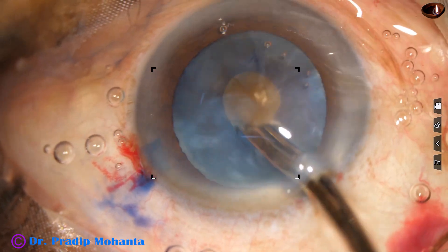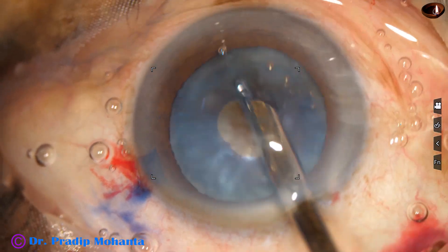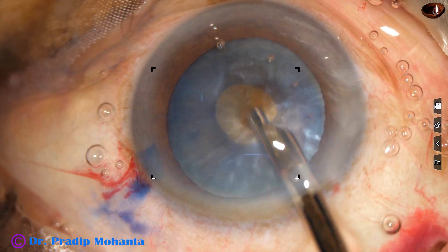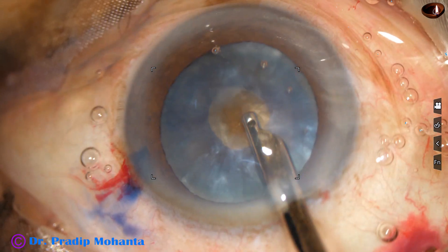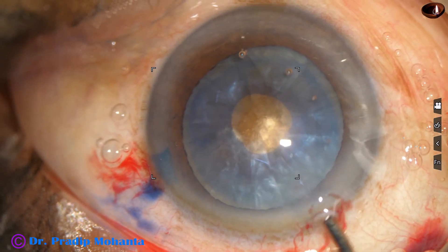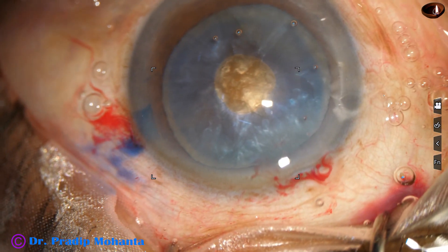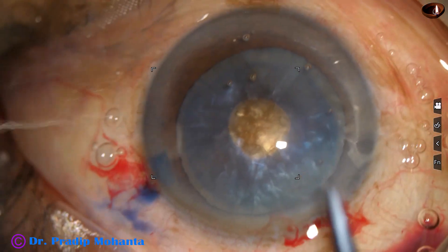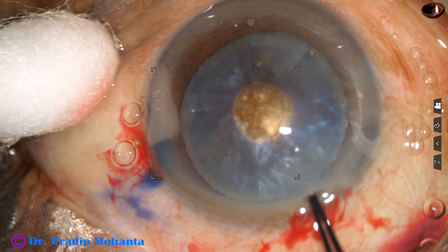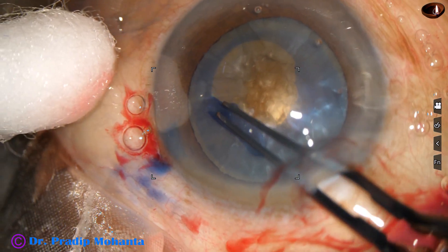So a small rhexis is made and some lens matter is aspirated. As this is done, we can see a brown hard nucleus. Nucleus sclerosis is grade 5 or even harder. So I remove some cortical lens matter, inject visco again, take a Vannas scissor and make a nick at the margin of the mini-rhexis, then use the cystiotome again to enlarge the mini-rhexis to get an adequate-sized rhexis.